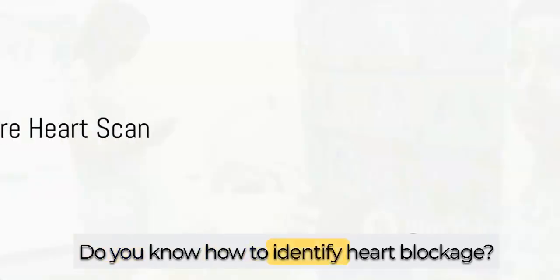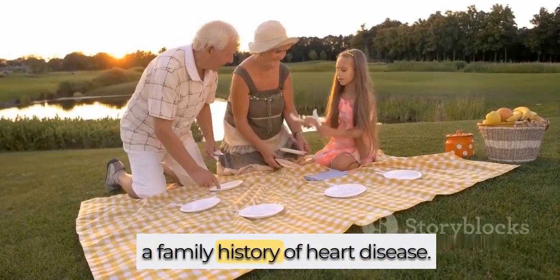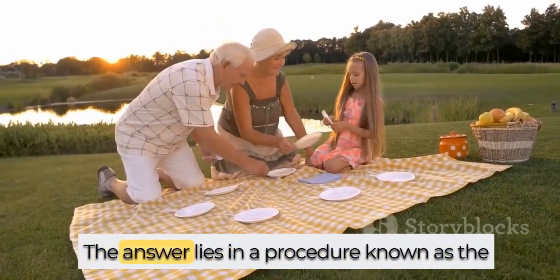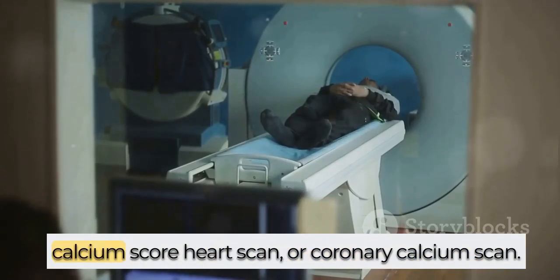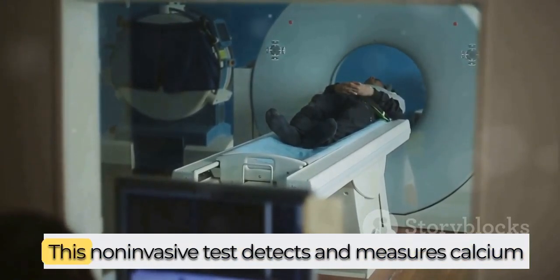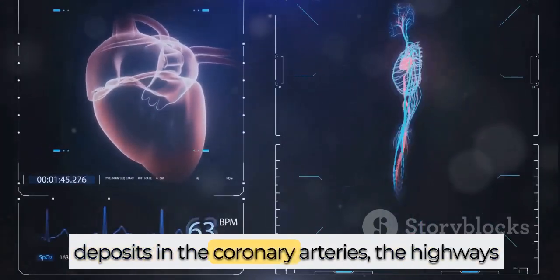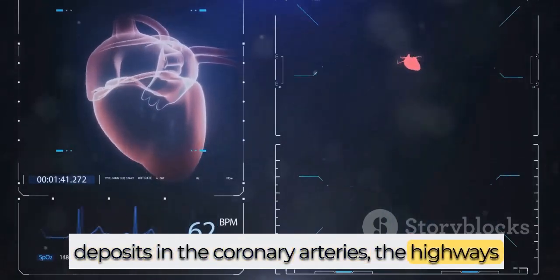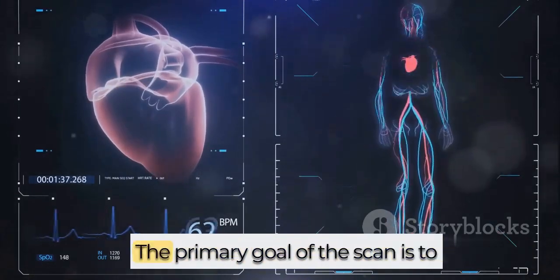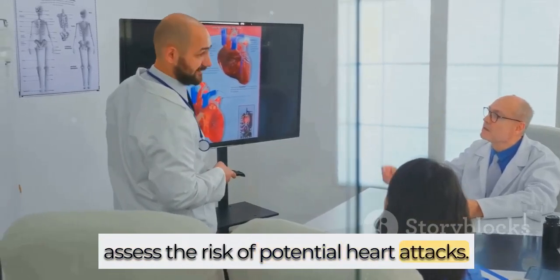Do you know how to identify heart blockage? It's a question that may stir curiosity in the health conscious and concern in those with a family history of heart disease. The answer lies in a procedure known as the calcium score heart scan, or coronary calcium scan. This non-invasive test detects and measures calcium deposits in the coronary arteries, the highways that supply blood to your heart. The primary goal of the scan is to assess the risk of potential heart attacks.